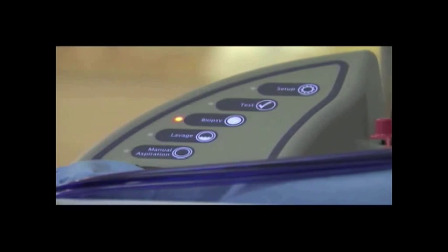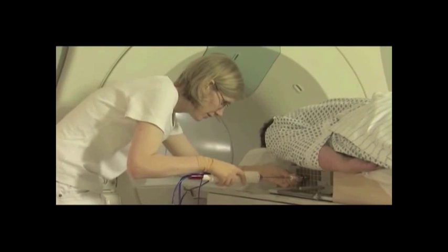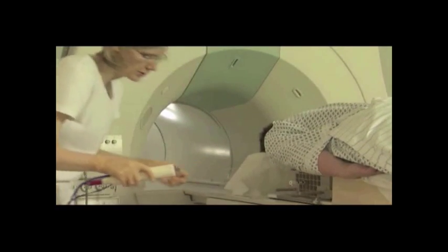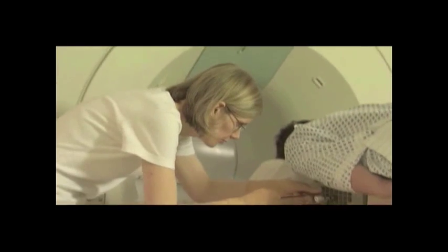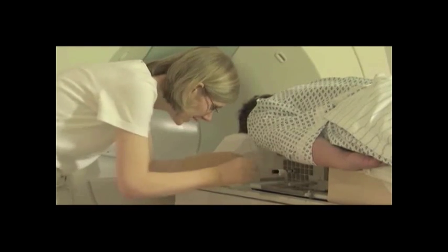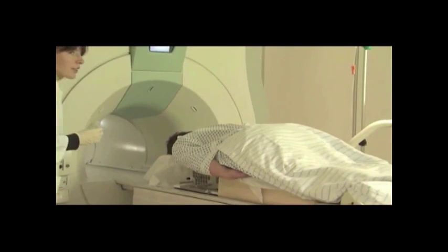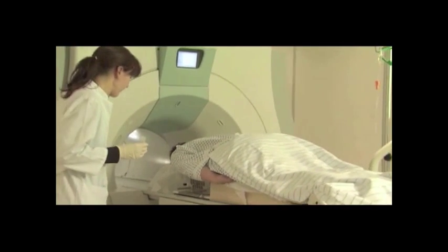Switch the console back to biopsy mode by pressing the button marked biopsy. Remove the ATEC handpiece while leaving the introducer sheath in place. To verify the successful biopsy of the area of interest, reinsert the localizing obturator back into the introducer sheath. Shuttle the patient back into the magnet for post-biopsy sagittal and axial image sequences.